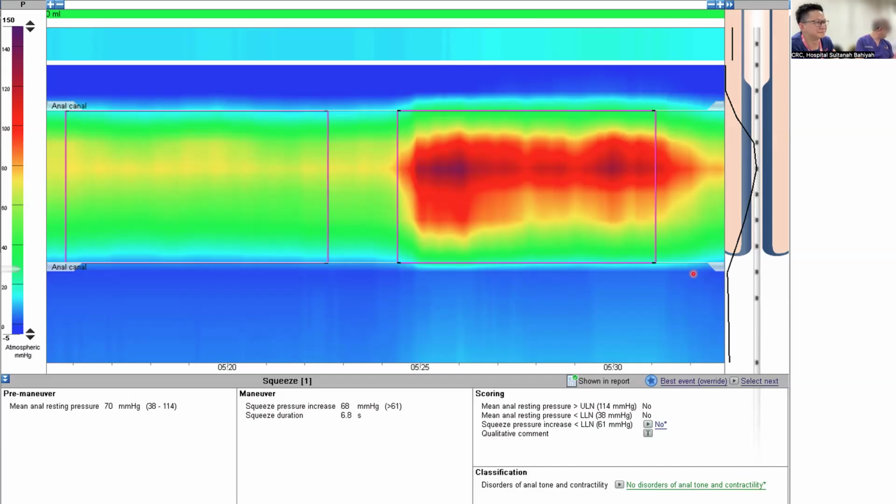How much is our biofeedback program? I guess it depends on what type. We have the EMG base. We also have the probe base, and the probe base can either be disposable or reusable. So obviously the most cost saving will be those that can be reused. And even if you have the EMG one, you can still use it for a couple of sessions before it cannot be used again. So I think the overall cost is not very expensive.